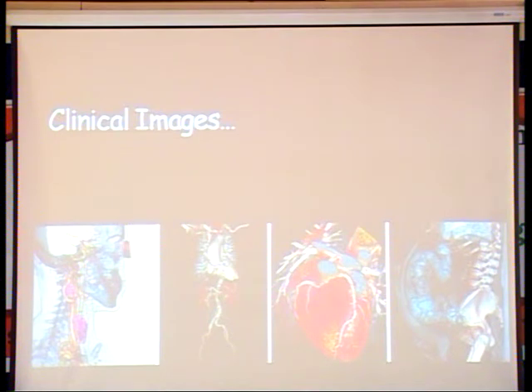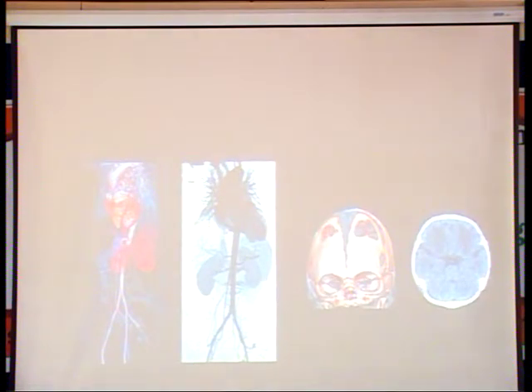So these images, if we talk about the software, there are huge advancements in CT software. In our profession we call it applications. These are all 3D images which have been reconstructed using the data acquired by the gantry or the CT scan. It has been reconstructed, or you can say post-processed, in a 3D form. And this is neuroperfusion.